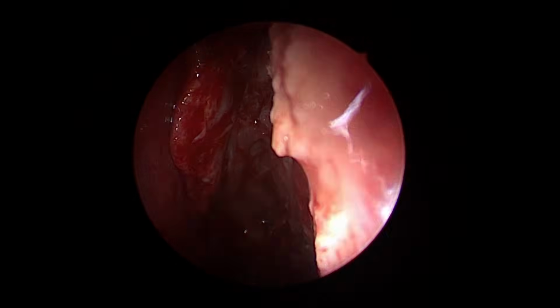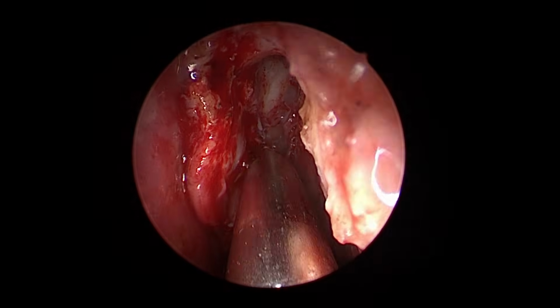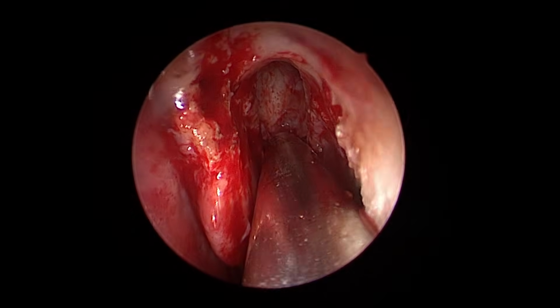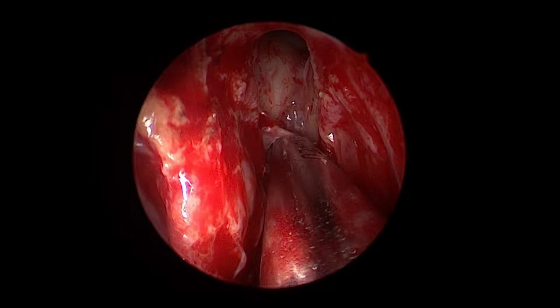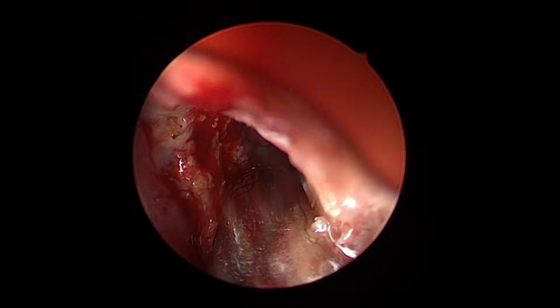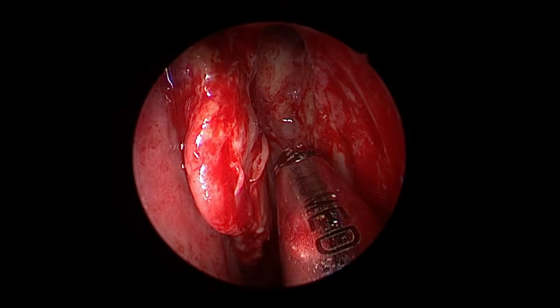Now next is the sphenoid and the post-ethmoid. See, having this done, we didn't even bother about mentioning the anterior ethmoidal artery. We did the entire frontal sinus job, and the anterior ethmoidal was of no mention. Why? Because we are working anteriorly and the anterior ethmoidal runs on the posterior-most part.